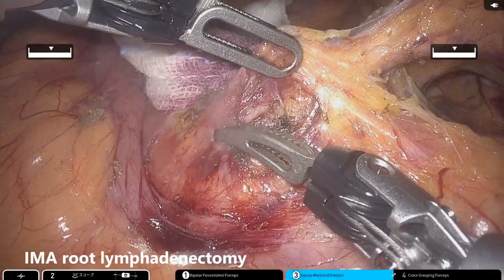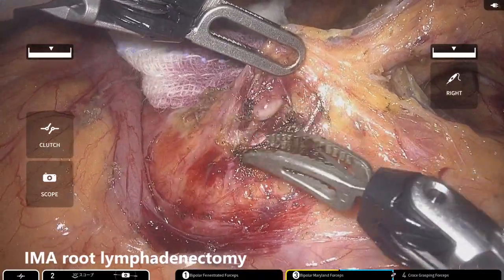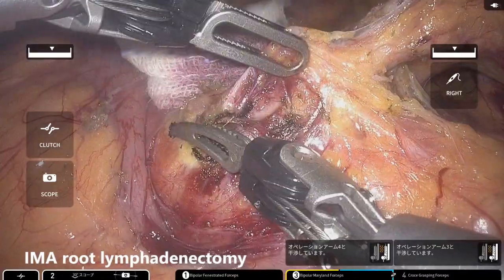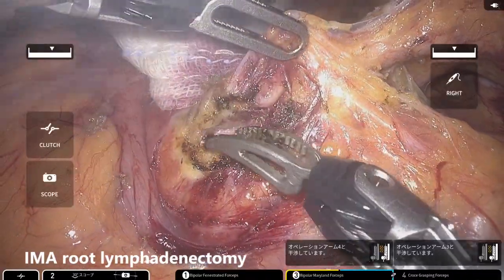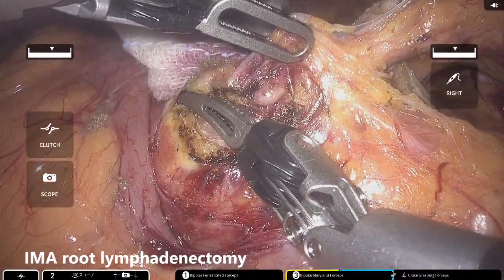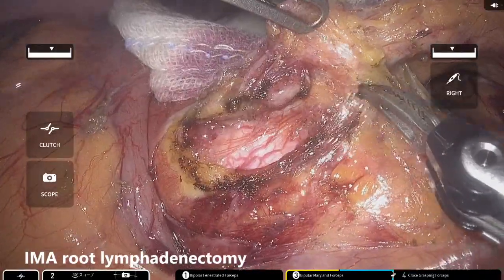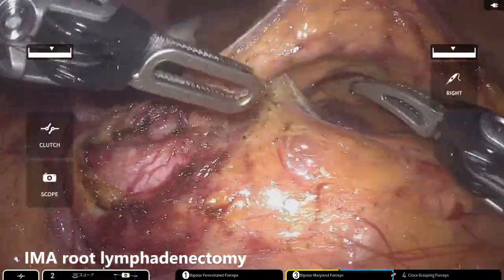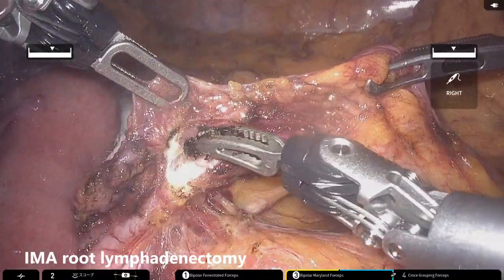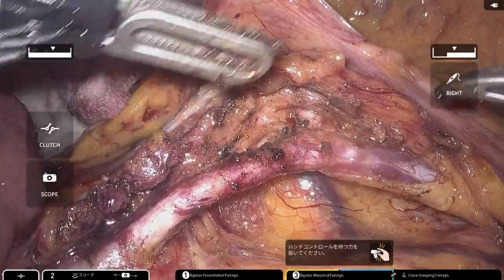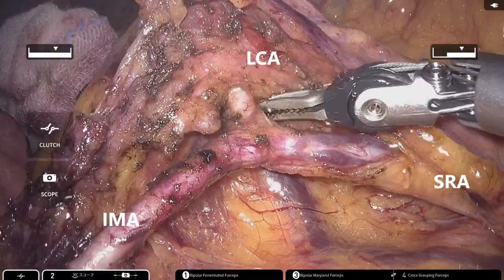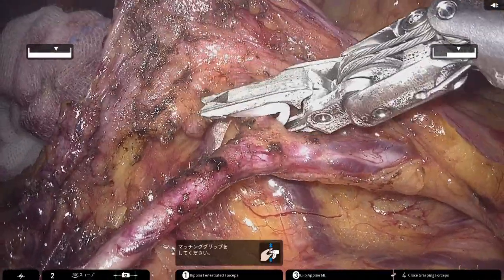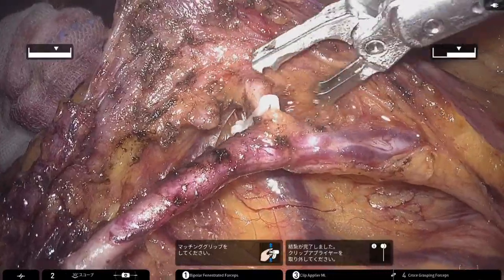Lymph node dissection is performed around the root of the inferior mesenteric artery using the double bipolar method. While preserving the inferior mesenteric artery trunk, dissection continues along the artery, clipping and dividing the root of the left colic artery.